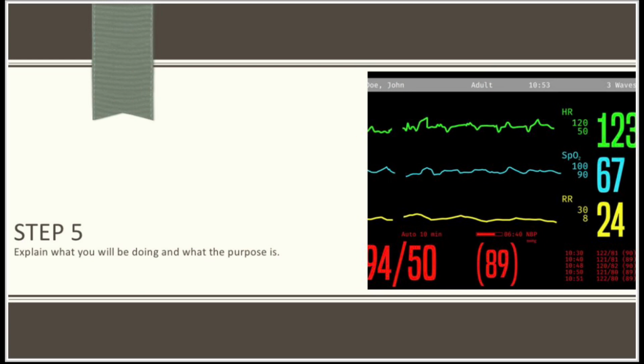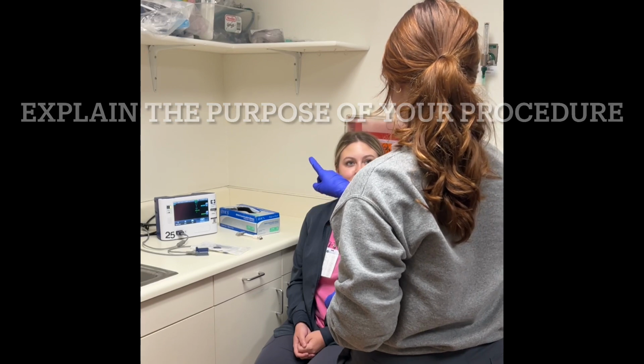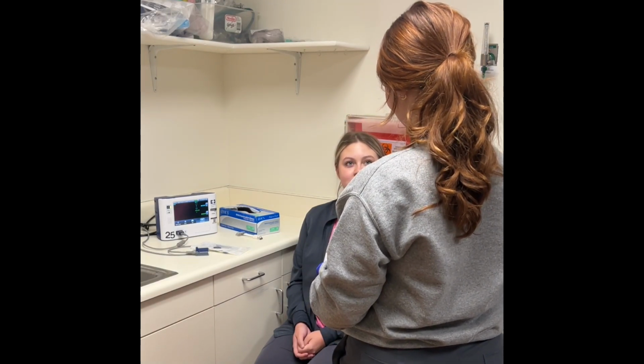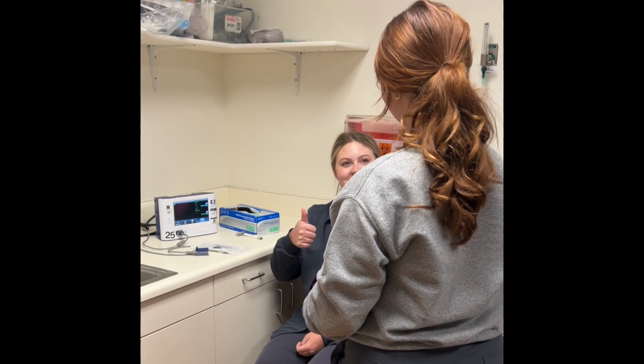Next, you will explain what you're doing and what the purpose of it is. I'm going to be taking your vitals today in order to appropriately monitor your physical health. This will include your heart rate, your respiratory rate, and your oxygen saturation. Do you have any questions?